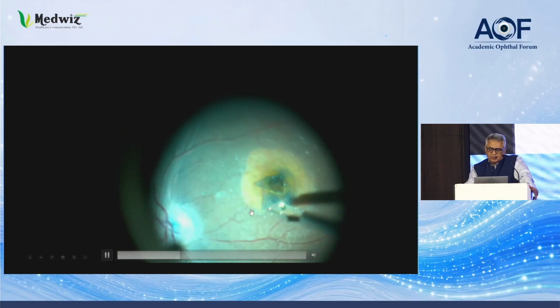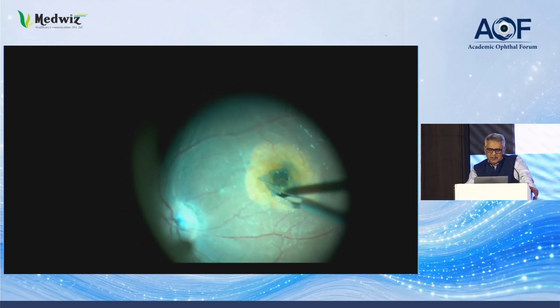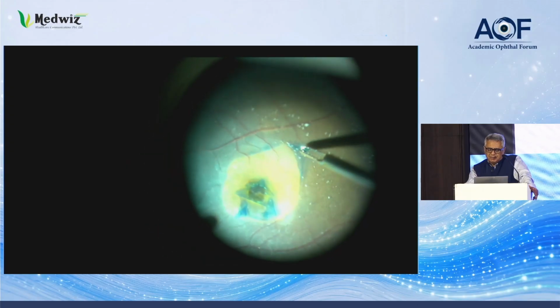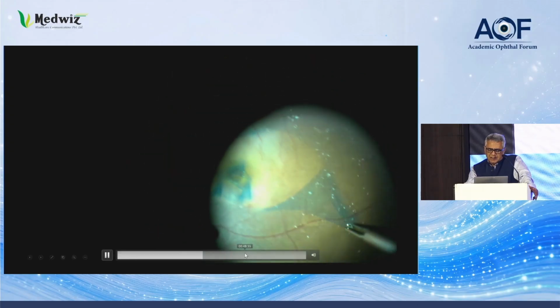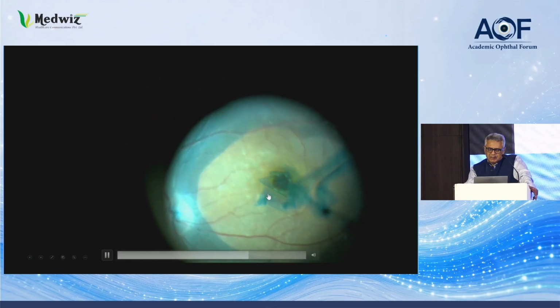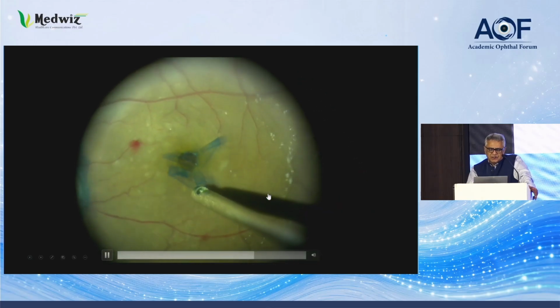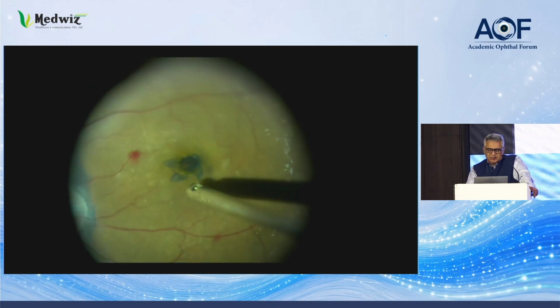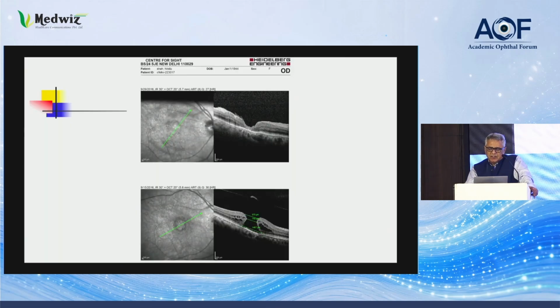I normally at least do this multi-layered kind of ILM. I know a lot of variations are there, and a lot of discussion can happen, but this is left at the end, and at the end you just take the cutter and trim it with the smallest possible section, the largest possible cut rate, and this is the end result.